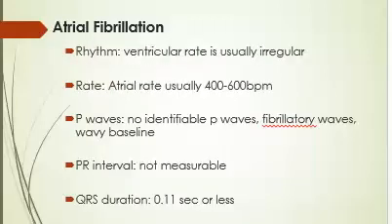I'm sure you guys have all been waiting on talking about atrial fibrillation. I know I have. Atrial fibrillation is the most common dysrhythmia out there. So let's talk about it. Lots of stuff can cause it. Basically, what's going on is that atrial activity is all jacked up. Yep, I put it out there. Sorry, my way of saying it.